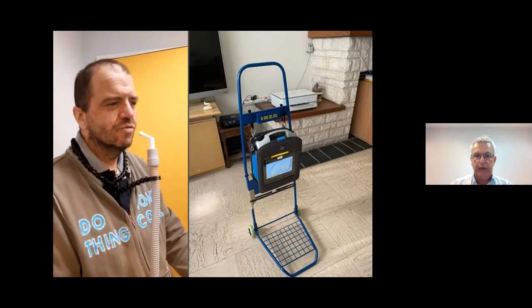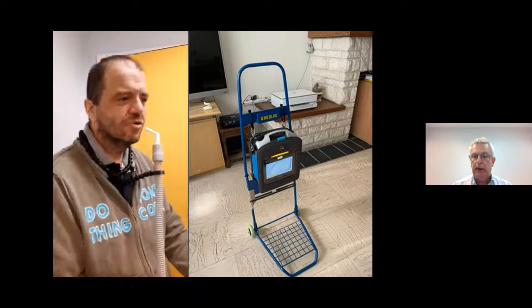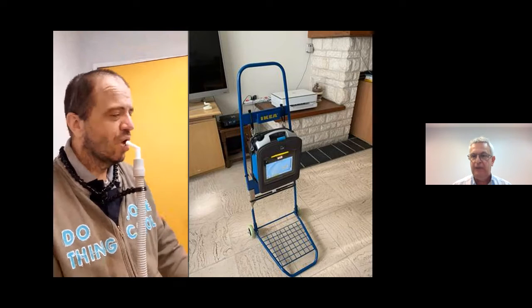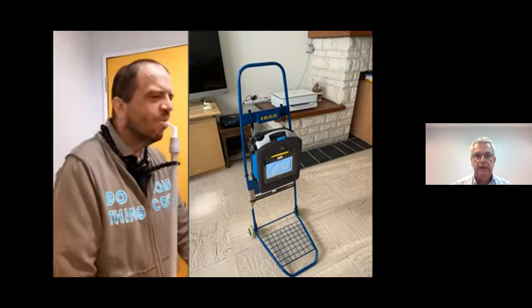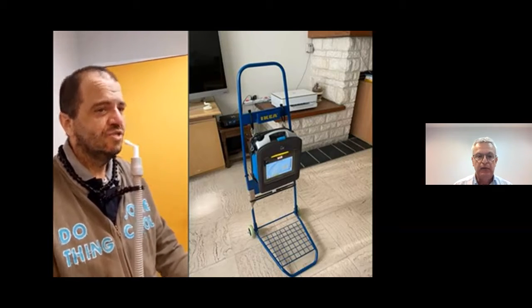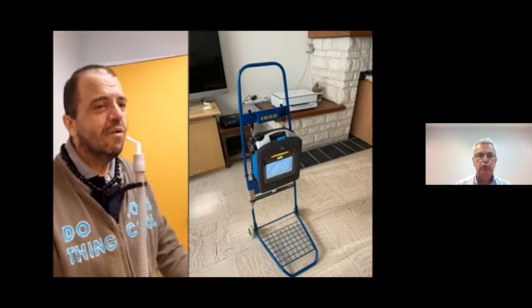Here I cut the sound so you can see only the man using the device. You see on the left side, this man is working, is living at home. I don't make any publicity for anything, but you see a trolley with a ventilator, and this man is using his mouthpiece during the daytime. As you can see, he's using a collar that we have made, and he's telling that it's fantastic to use that system with two free hands. When he wants some air, he just connects to the mouthpiece and disconnects for speaking. So it is a system where patients have to play their own role.